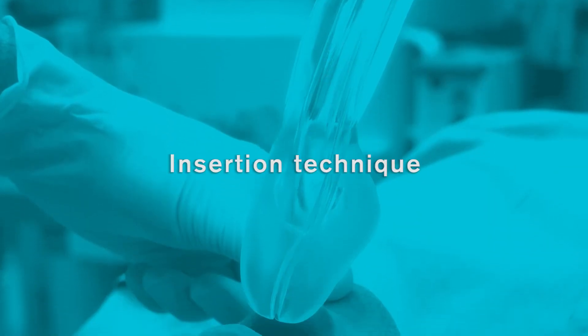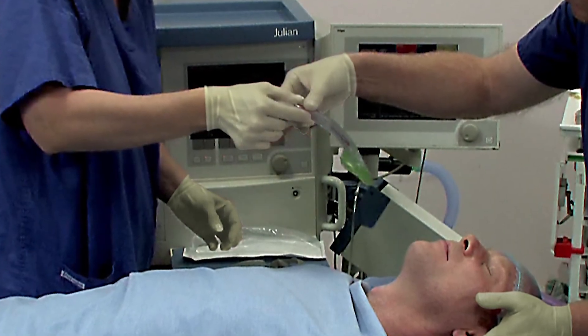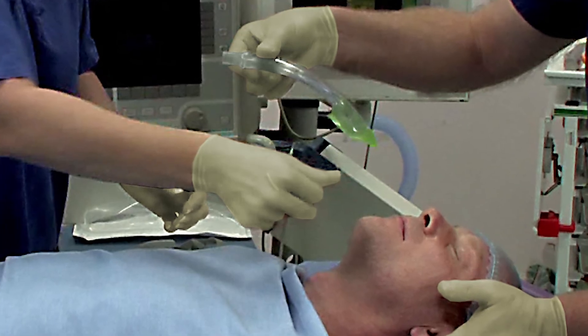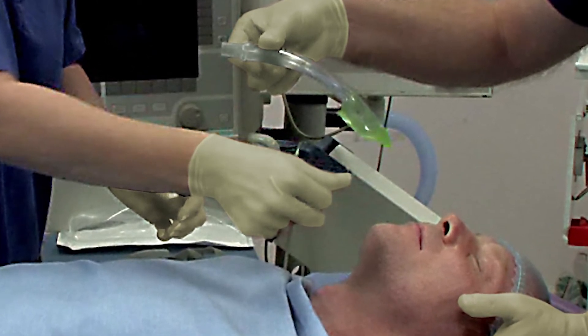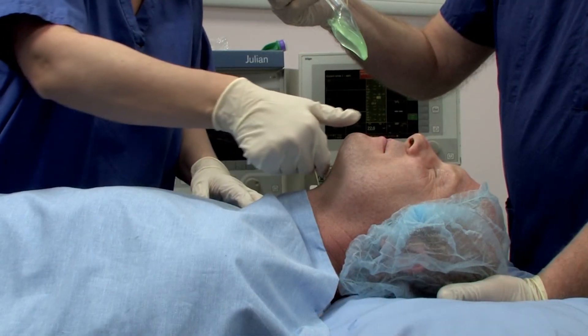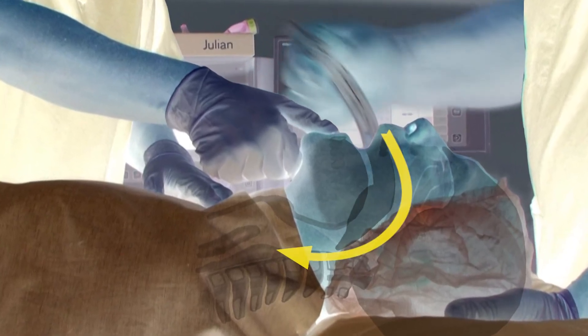Insertion Technique: A proficient user can achieve insertion in less than 5 seconds. Remove the iGel from the protective cradle or cage pack and grasp the lubricated iGel firmly along the integral bite block. Position the device so that the iGel cuff outlet is facing towards the chin of the patient. The patient should be in the sniffing the morning air position with head extended and neck flexed. The chin should be gently pressed down before proceeding to insert. Introduce the leading soft tip into the mouth of the patient in a direction towards the hard palate. Glide the device downwards and backwards along the hard palate with a continuous but gentle push until a definitive resistance is felt.